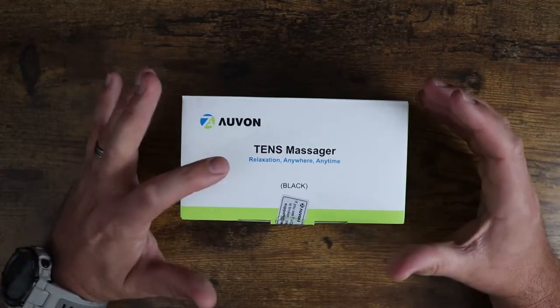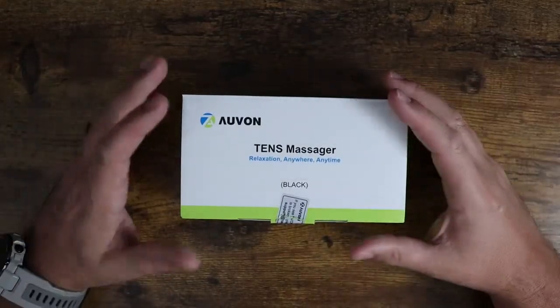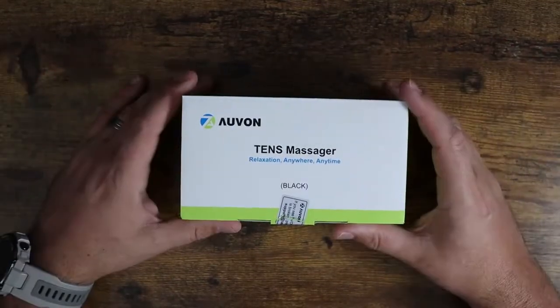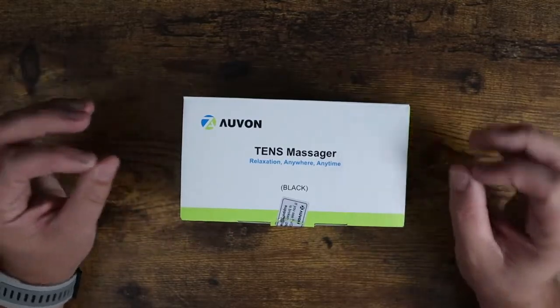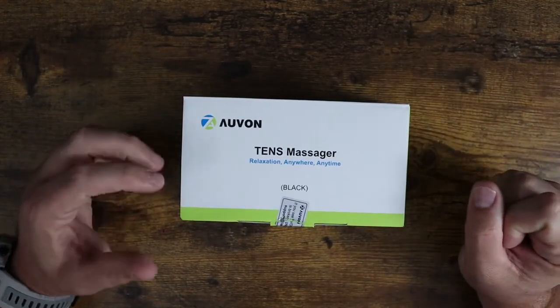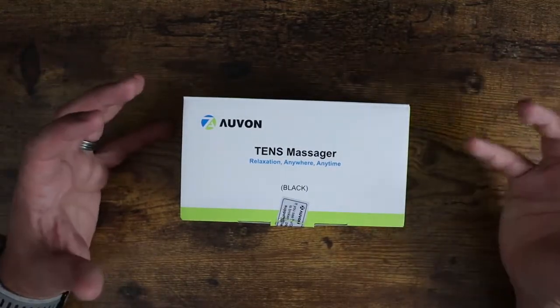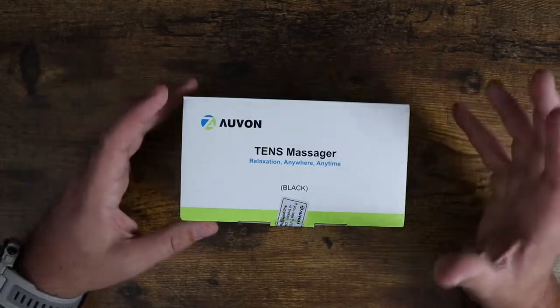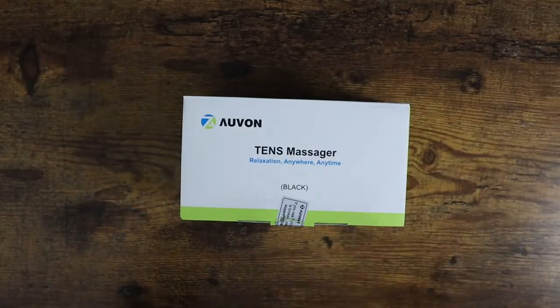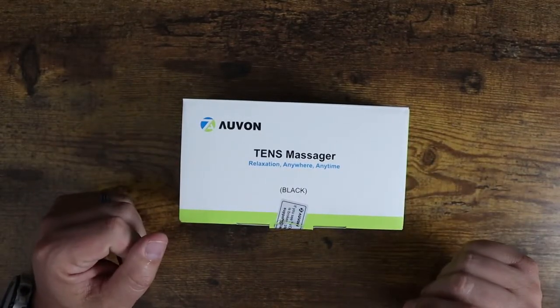What's going on guys? So today I want to show you the Avon TENS Massager Relaxation — Anytime Anywhere is what it says basically. What this is, is a TENS machine which uses small electrical pulses to reduce pain and help with relaxation. It just helps with reducing pain and swelling, all sorts of great stuff. You can apply this specifically where you need it and it's got a ton of settings and adjustments, so let me open this up and show you what you get in the box.